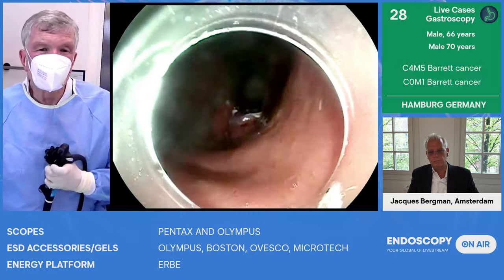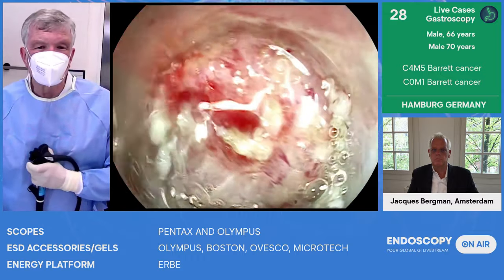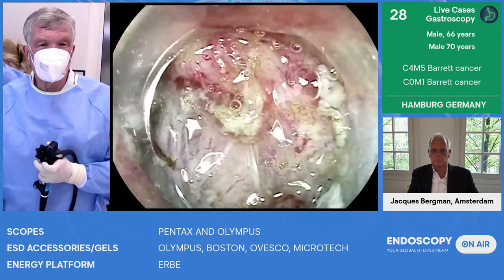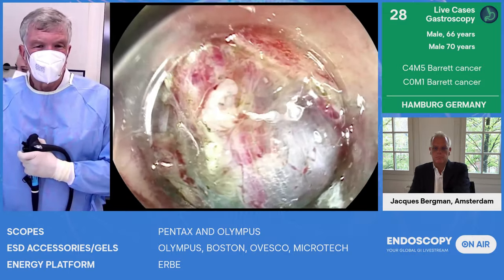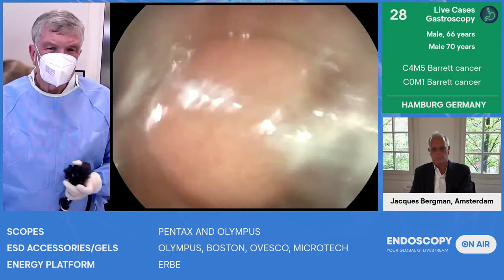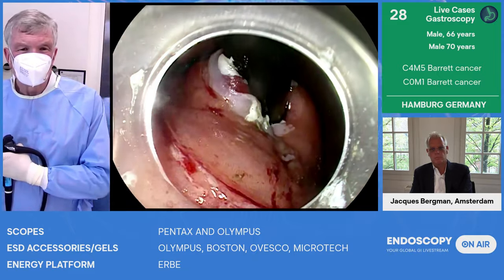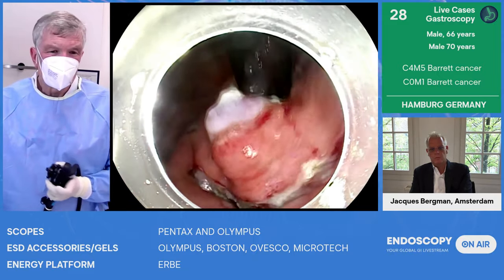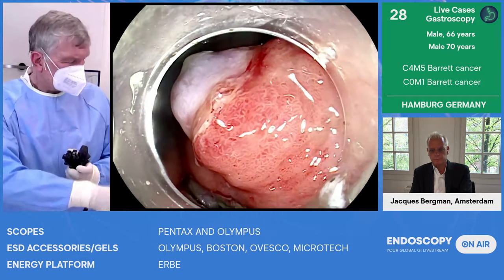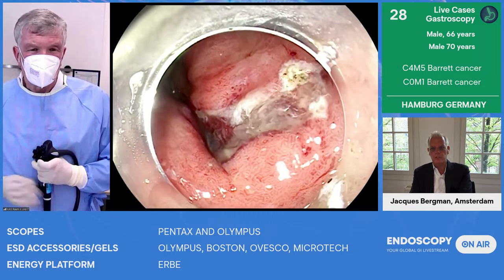And then I show you what Chuck meant with retroversion. That's also a nice way to hook yourself in, like here. See that? If you have a scope which retroflexes nicely. So here we will go on, and then continue. Here you see the lesion in inversion. Yeah, so ideally you'd like to do as much as you can in inversion.